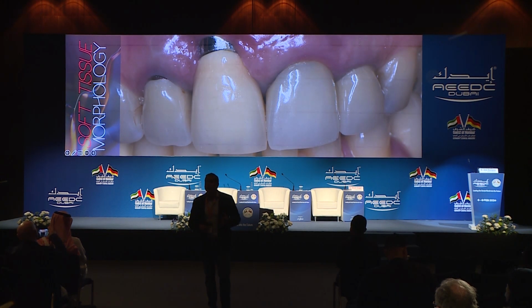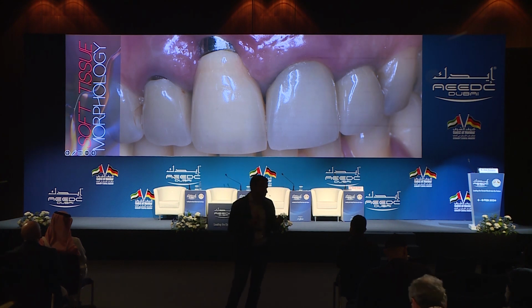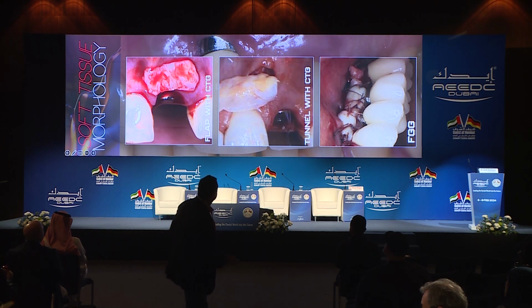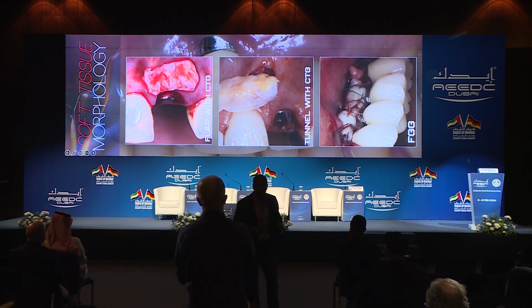In case you have a thin biotype, and what I mean by thin biotype is less than 1 millimeter of tissue thickness, if you don't have keratinized mucosa, if you don't have an attached mucosa around these implants, please, it takes you 5 to 10 minutes. You have many techniques. You can graft it as a connective tissue graft, you can place it as a tunnel if you wish, or you can do it at the second stage as a free gingival graft to support your prosthesis.